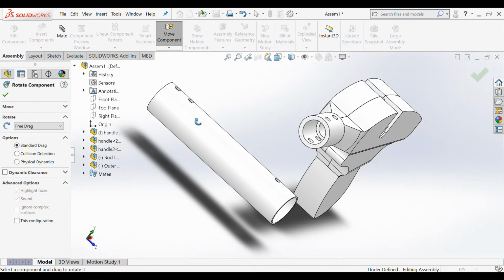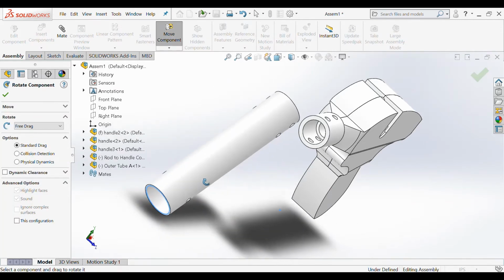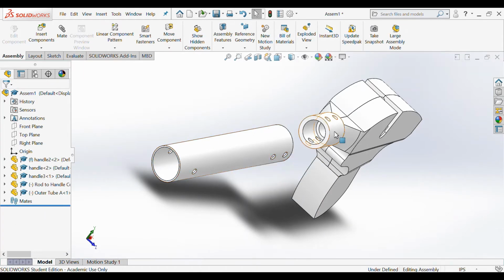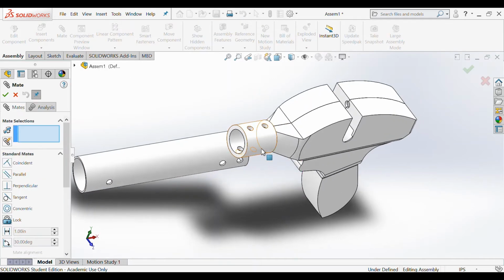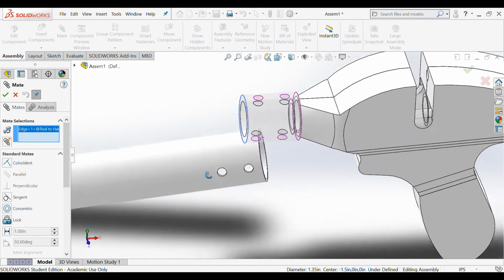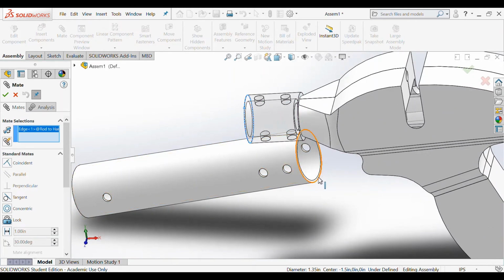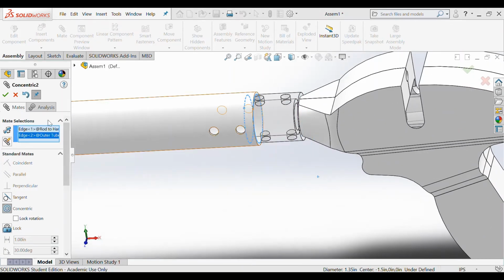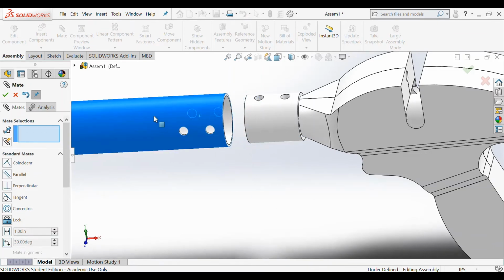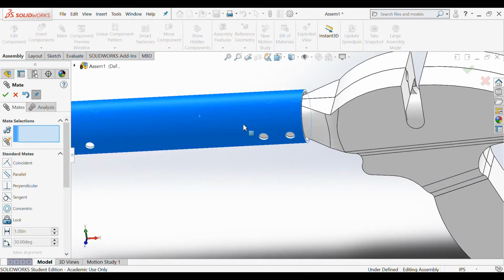Now I'm going to rotate this component to make it easier to assemble. As you can see, we have these two holes here and the two holes here. So we're going to do a similar mate. We're going to click on the outer circle of the connector piece. We're going to rotate this guy. We're going to click on the inner circle. I'm going to make them concentric. So see, you can move it around as long as the two holes align.